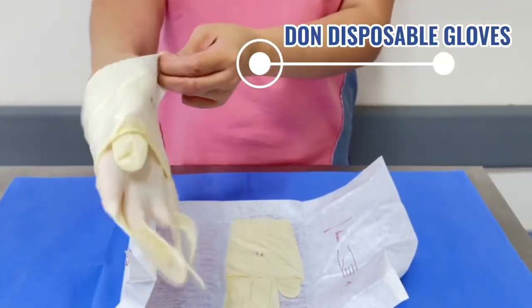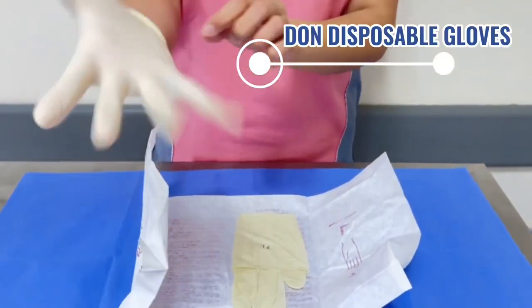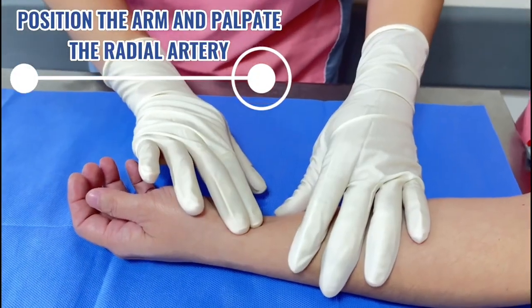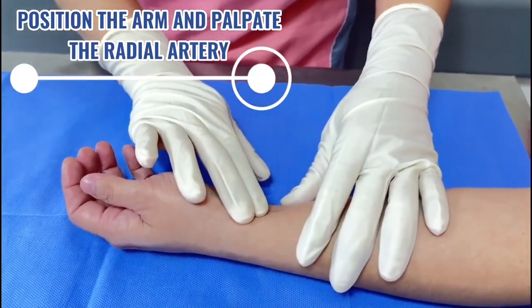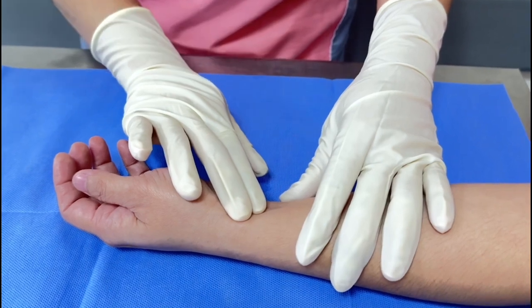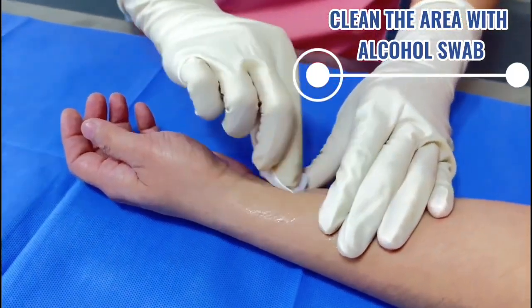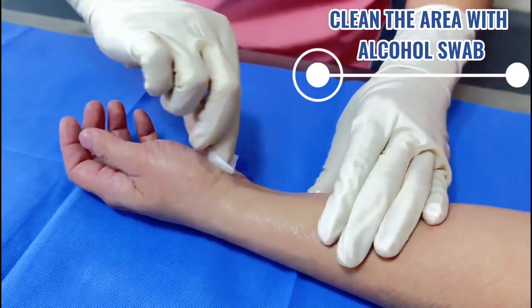Then, put on disposable gloves. Position the arm and palpate the radial artery. Clean the area with antiseptic skin preparation or alcohol swab.